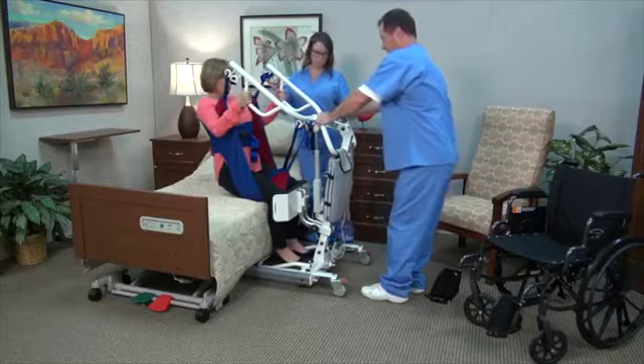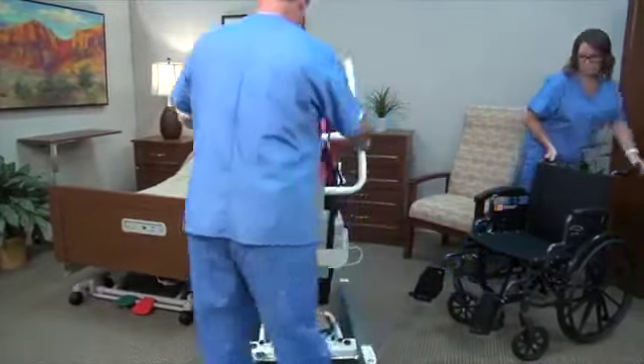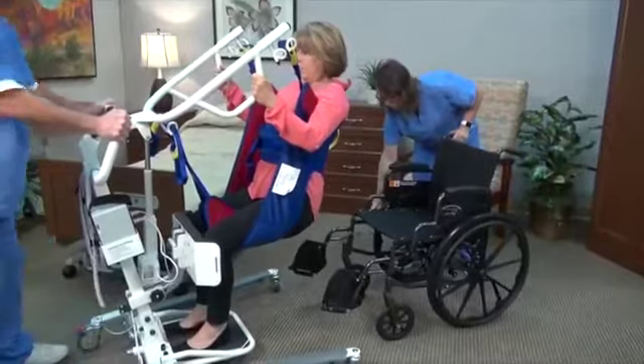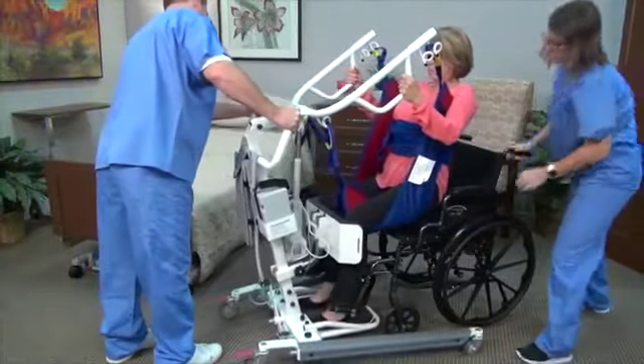The resident's knees may move away from the knee pad when they are upright. Close the base. When transferring to or from a wheelchair, be sure that the wheels of the wheelchair are locked in place.